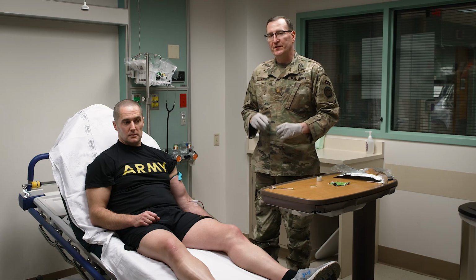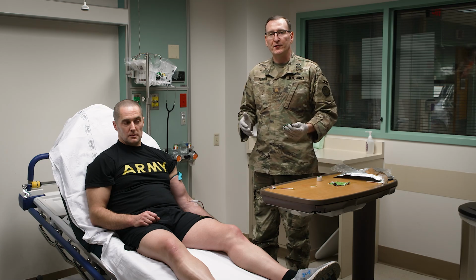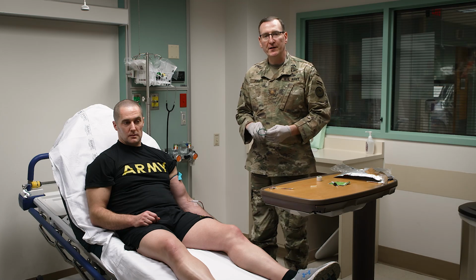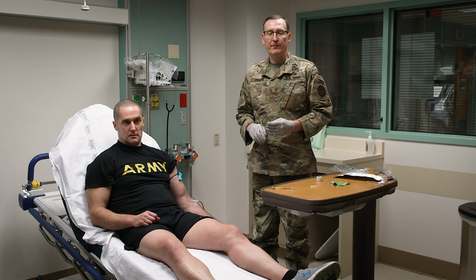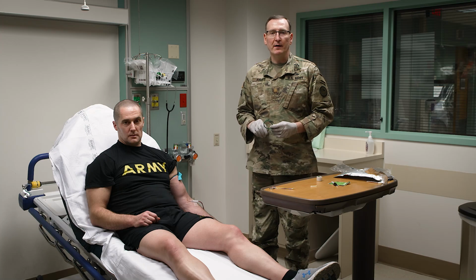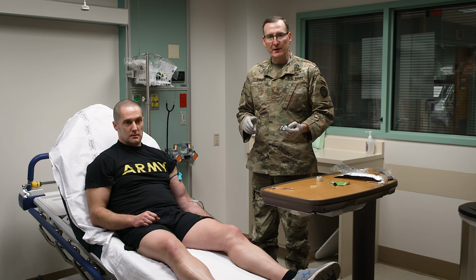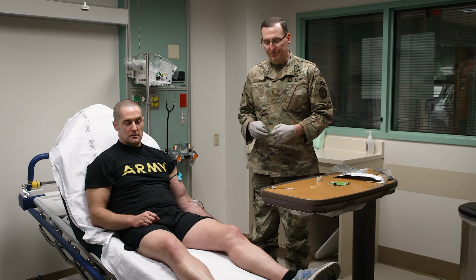Now, if you are in an austere setting, typically you're not going to have scales available, but maybe you do. If you have scales available, that's fantastic. You want to make sure it weighs approximately 580 grams, plus or minus 10%. That's approximately 450 milliliters, plus or minus 10%.